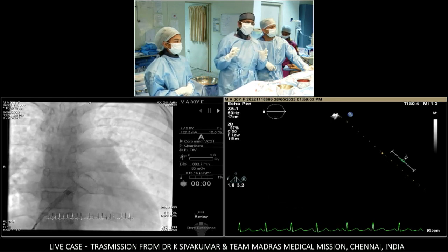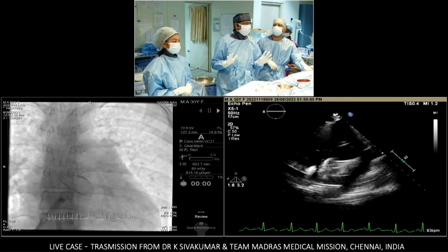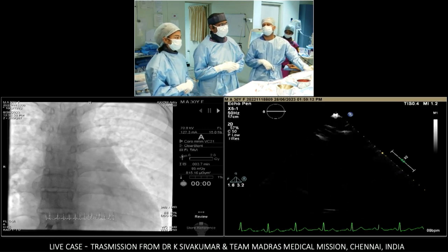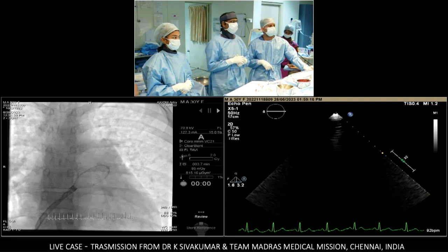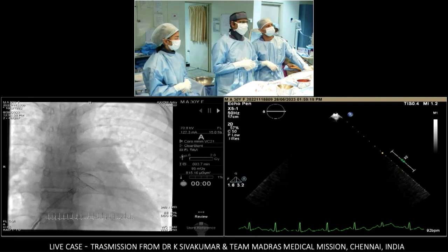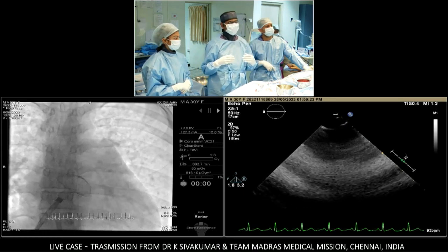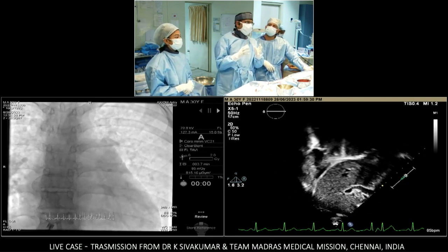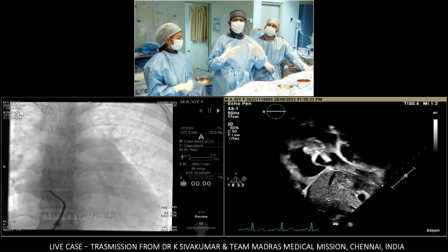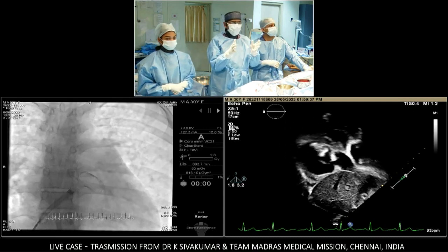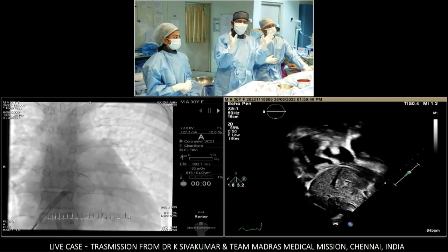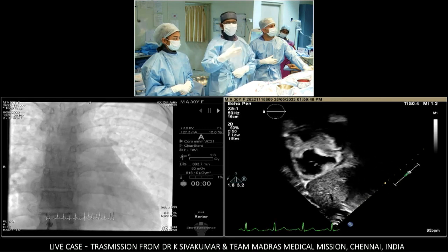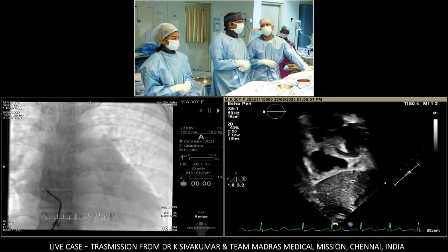The differential waist concept is probably best understood as a way of reducing the number of devices in inventory rather than a precise clinical tool. It's going to be very difficult to plan exact positioning of a specific waist. The left atrial disc never fully opens until the right atrial disc itself opens, because as long as the waist is constrained the LA disc is more like a ball. The concept of catching a distal, mid, or proximal waist doesn't really make practical sense.